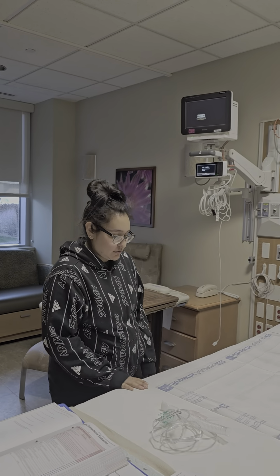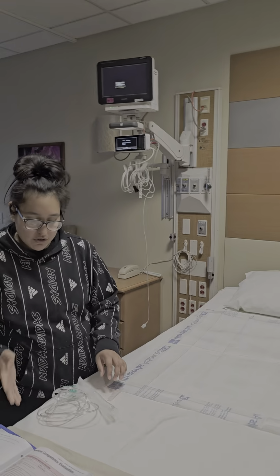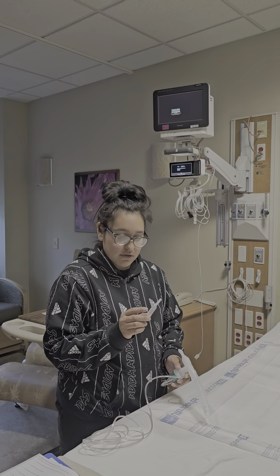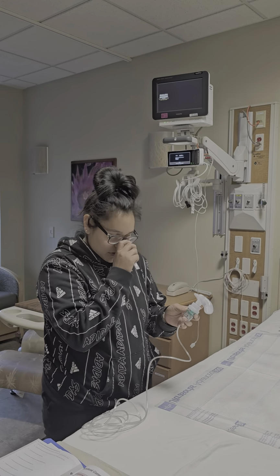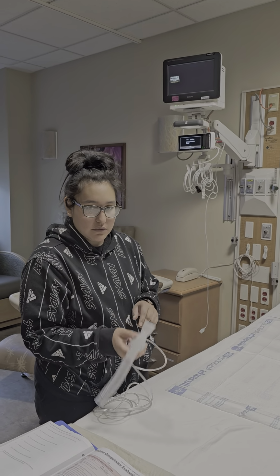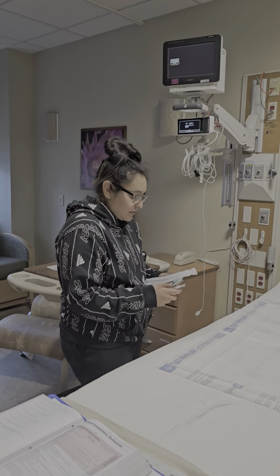Want to check physician's orders to make sure they have a physician order for this treatment. You want to wash your hands, gather equipment, make sure it's the correct medication, dosage, check for the expiration date, make sure you have the correct device. In this case, we're going to use a small volume nebulizer. We can take a mouthpiece and a nebulizer mask, just in case they weren't able to hold it.